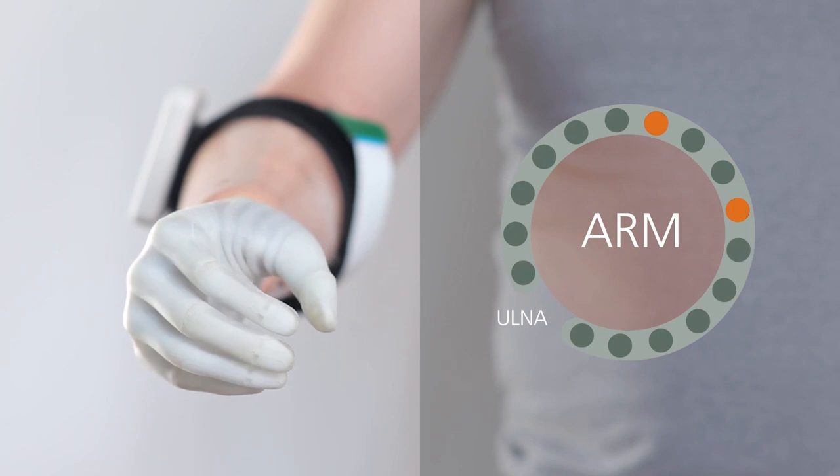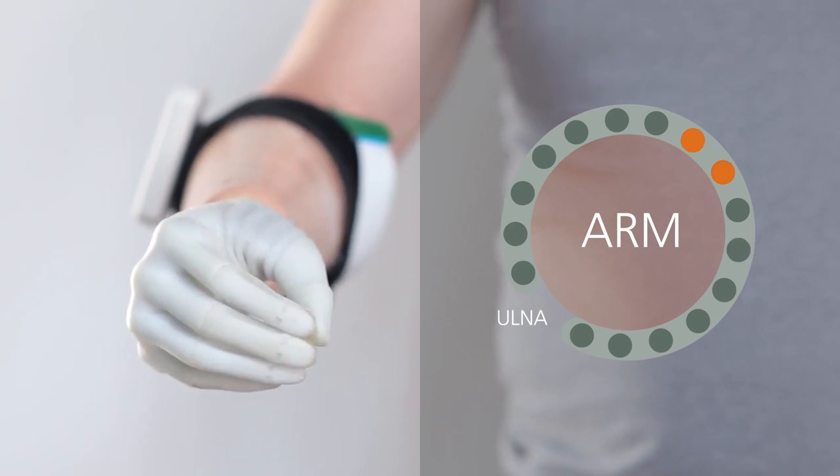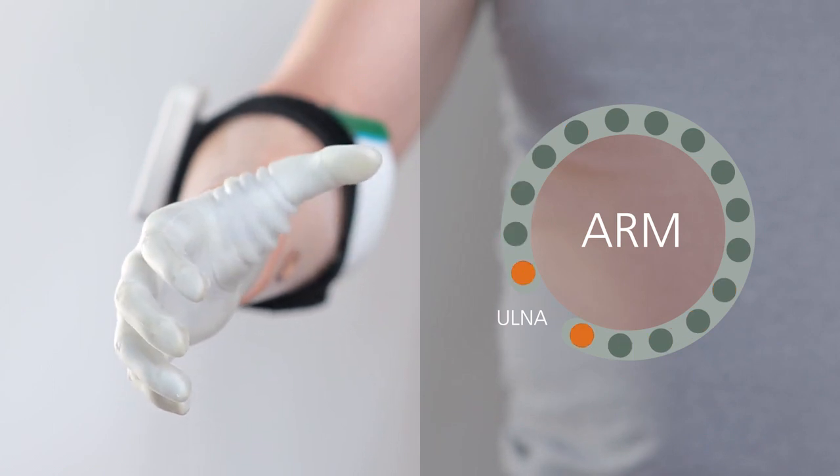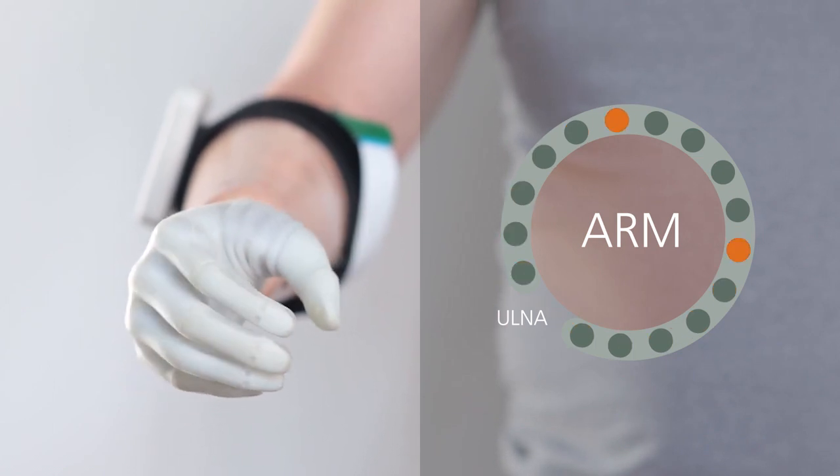The core of the MaxSense system is the intuitive and easy-to-learn electro-tactile feedback that resembles the performed movement. Hand opening is coded by two active electrode pads moving away from each other.